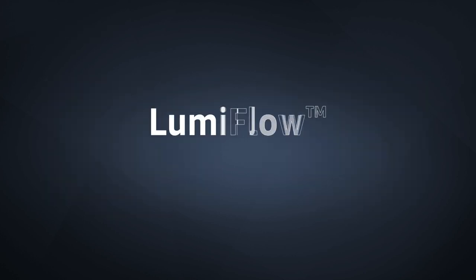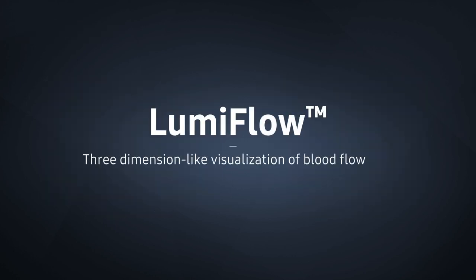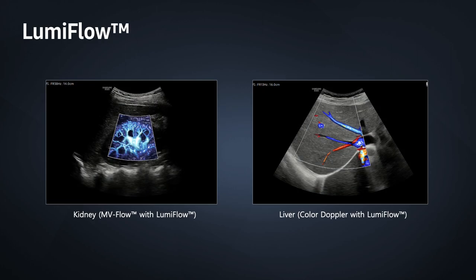Lumi-Flow displays a three-dimensional-like appearance to 2D color Doppler. Lumi-Flow electronically integrates light and shadow effects to transform the appearance of flat images into vibrant three-dimensional objects. The dimensional enhancement aids in quickly understanding vessel boundaries and spatial comprehension of complex vascular anatomy.